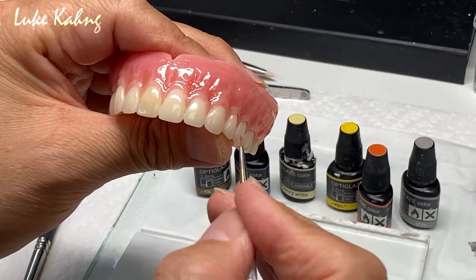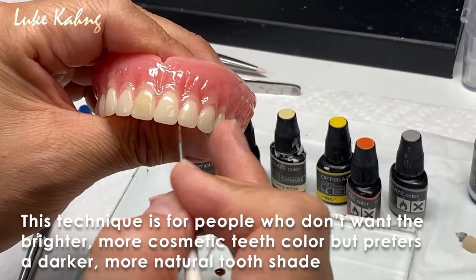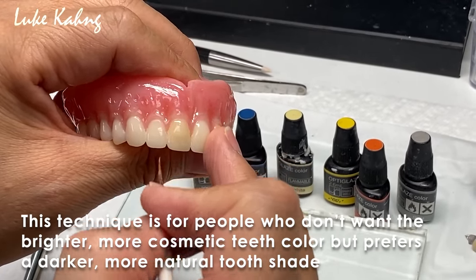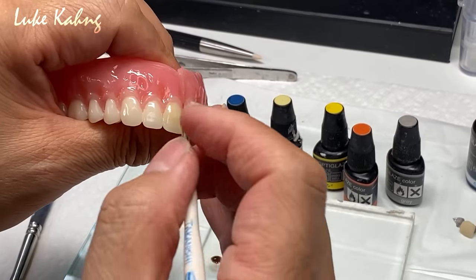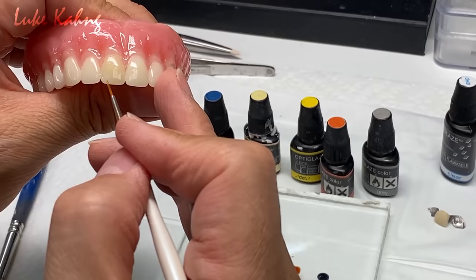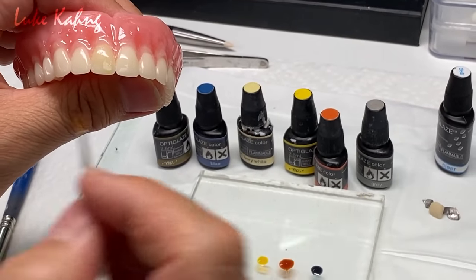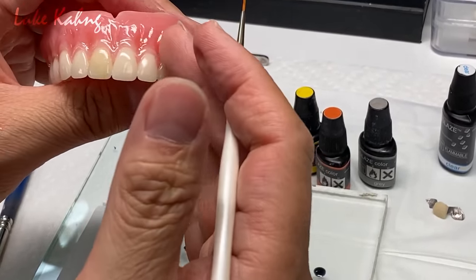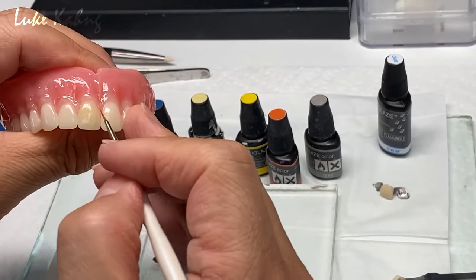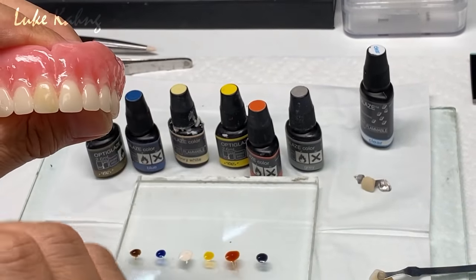Who doesn't want light color? Who wants the more darker color compared to this? We're saving the old denture with the light cure. Yellow here, just subtle, right? Effect line too.